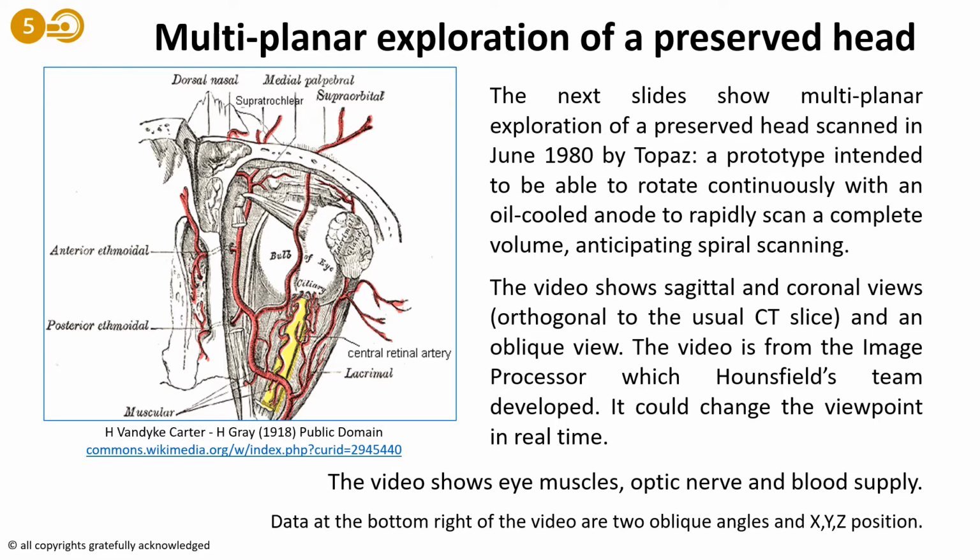The preserved human head was obtained by our colleague David King, who had been working with Godfrey for a year or 2 before I joined. He was an incredibly energetic and talented person, an English person, but when I knew him, he'd moved to the United States. And he provided the head, and I took the scans that you're about to see on the Topaz prototype, which is described in this slide.